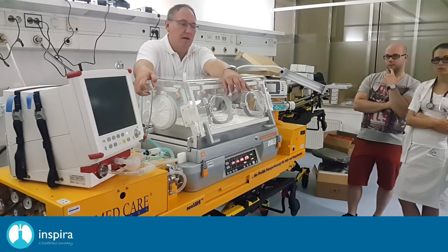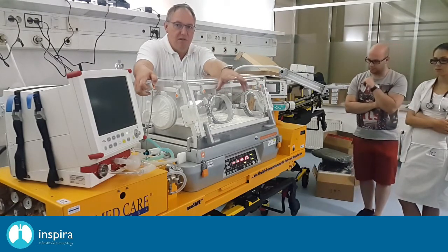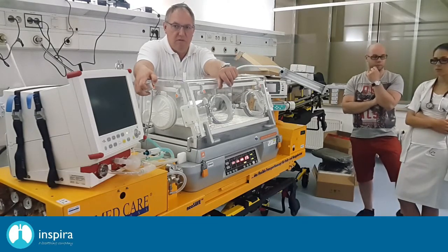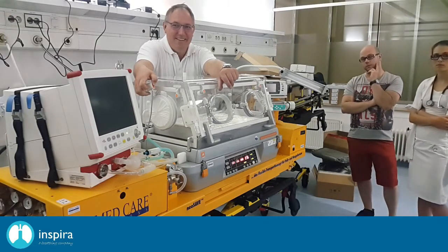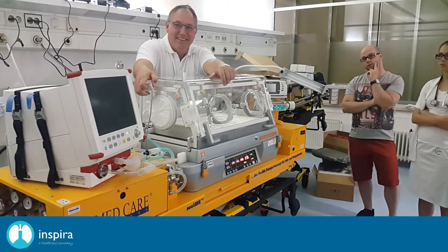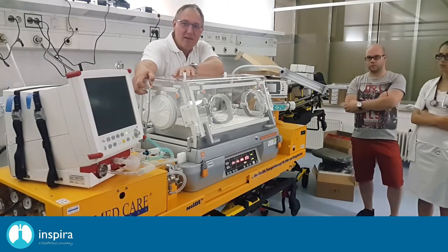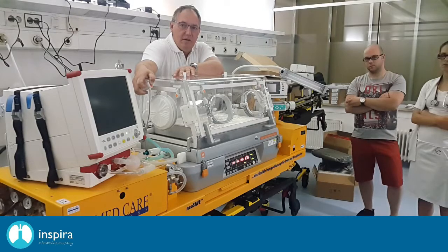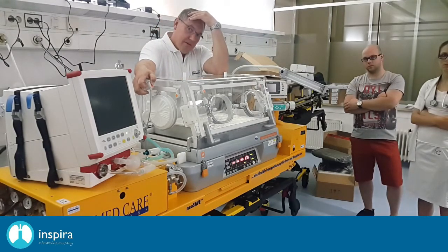No. No, okay. Because we have that normally in other ventilators. If you have installed the option high flow, you can do it, but then you now have the choice no with here. We can do it if we switch to non-invasive ventilation and we set up manual flow. Thank you. I'm not familiar with the Leonie, you know, that's the reason why I'm asking, but normally it's working. In nasal CPAP you can choose automatic flow delivery, it will choose according to leak compensation, or manual flow delivery, which is maybe better for transport because of the consumption.